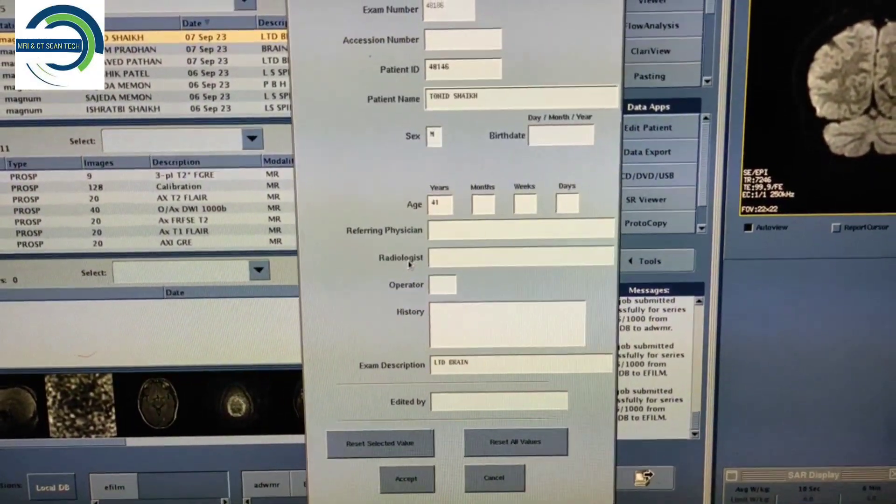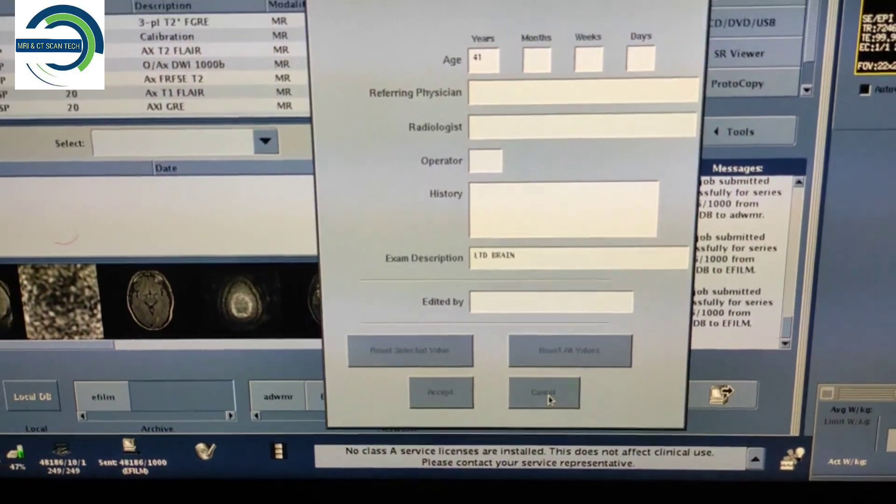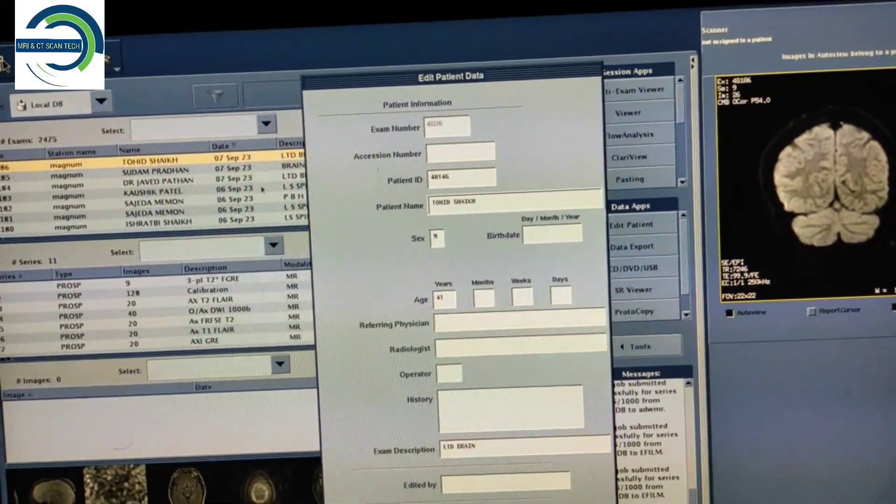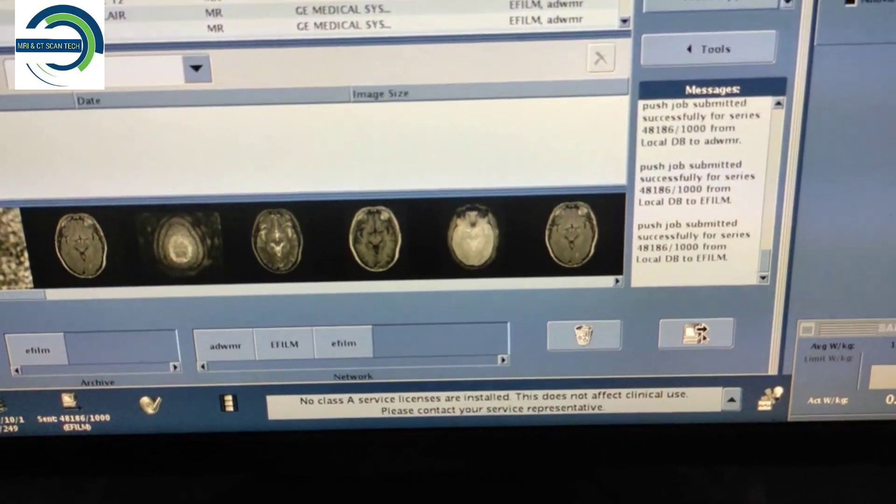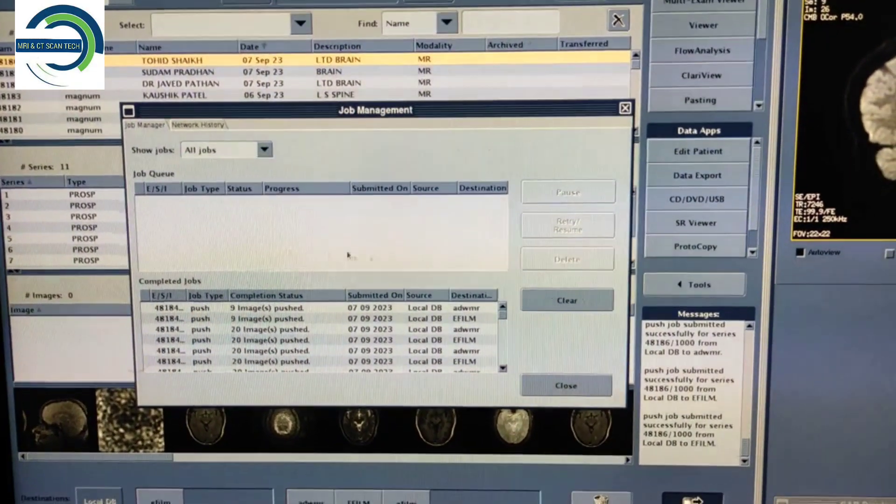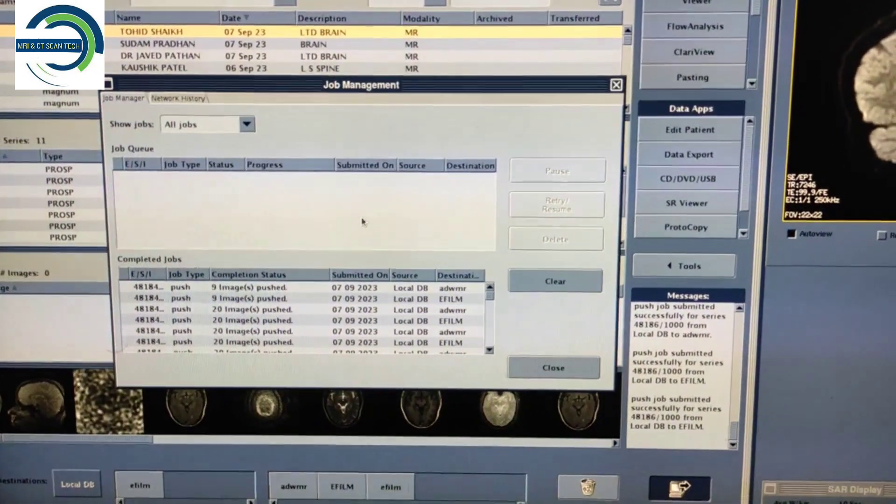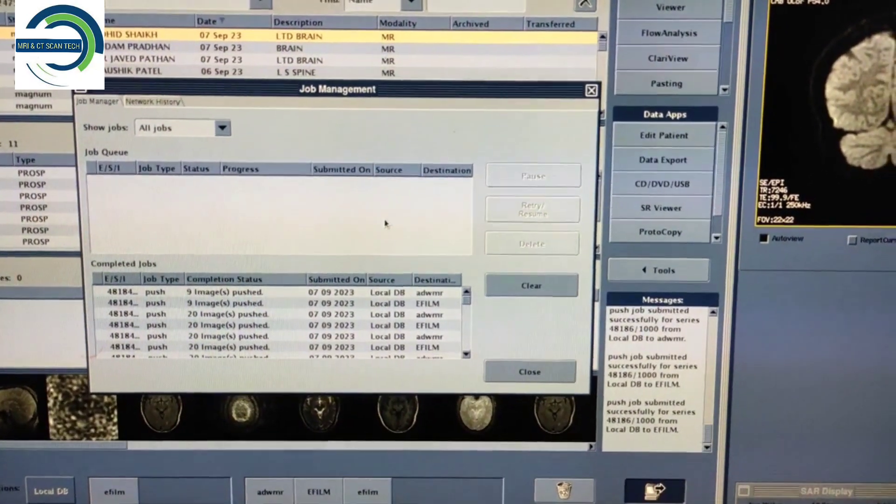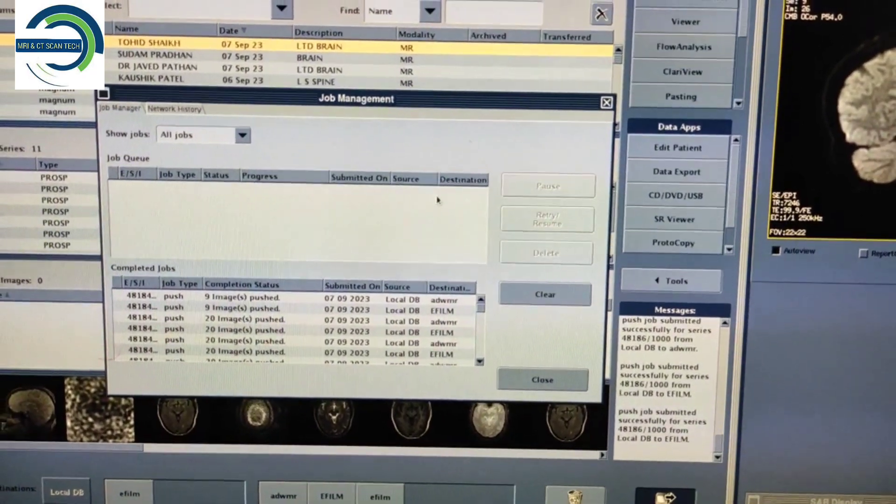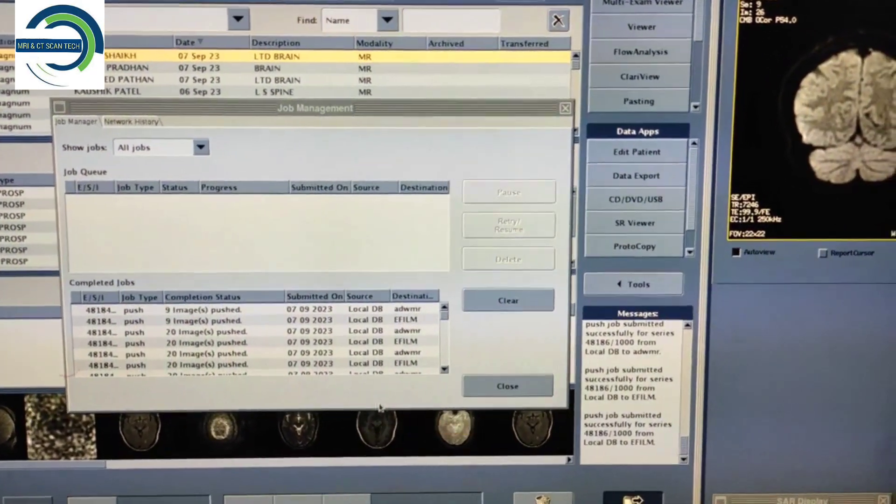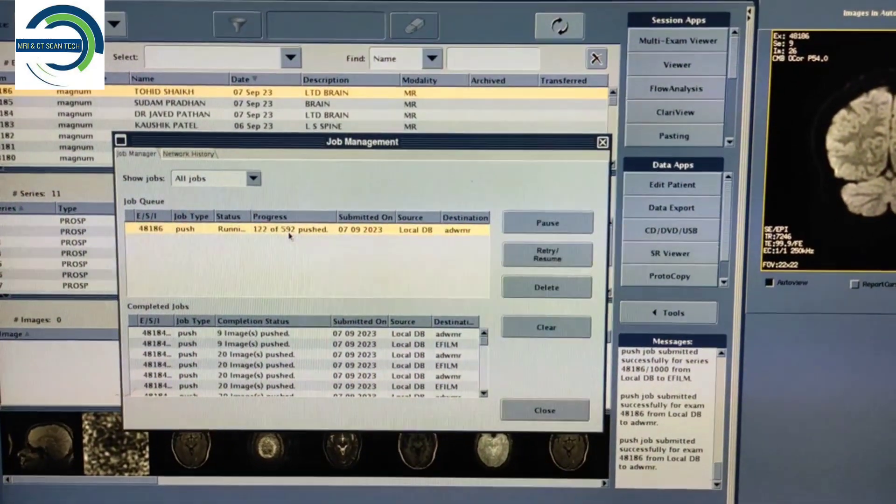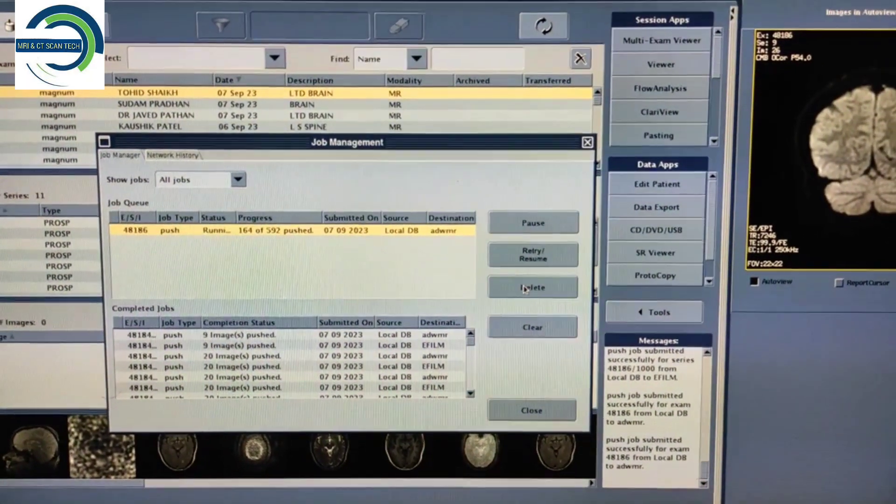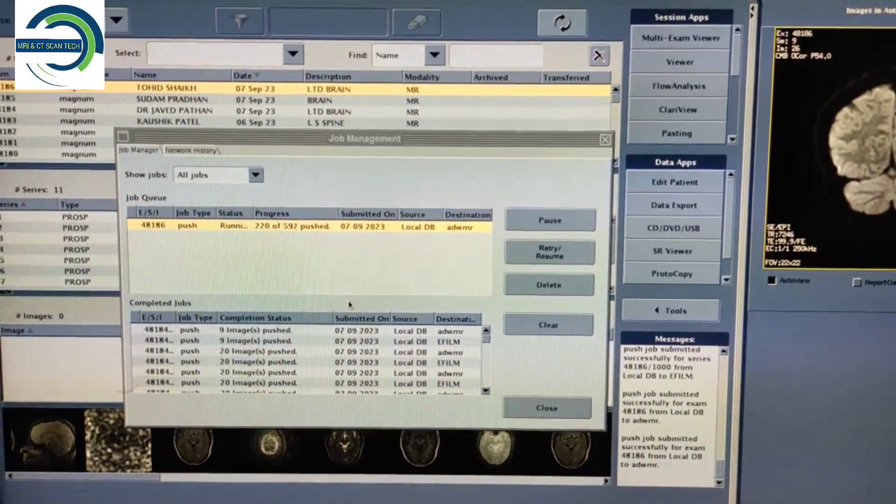Second thing, sometimes what happens is your data is also getting transferred to some other software. In that case, you have to open that interface and if data is already getting transferred, you can see over here you have to select that series and delete from that also.